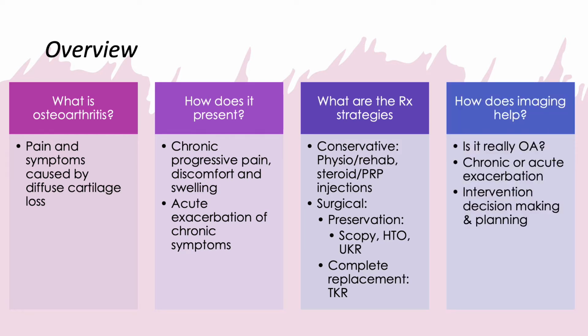How does imaging help? Imaging helps us to determine whether the cause of the patient's symptoms is actually osteoarthritis, whether this is chronic osteoarthritis or an acute exacerbation of osteoarthritis, and helping us with intervention planning and decision making.